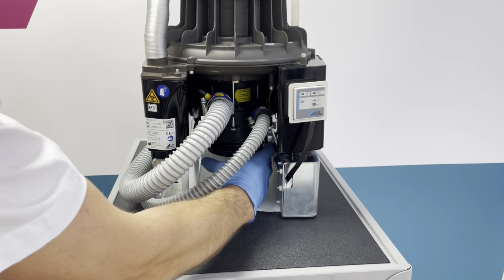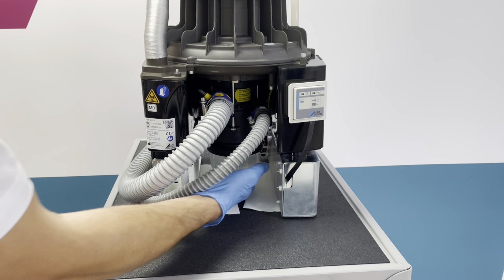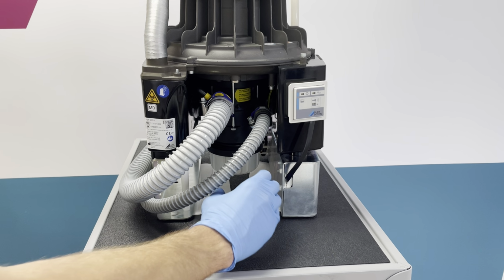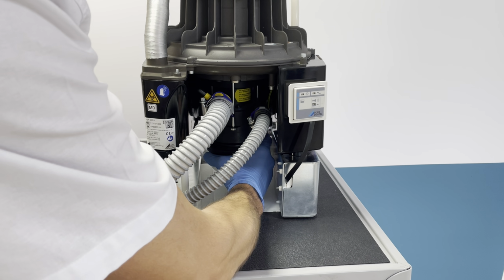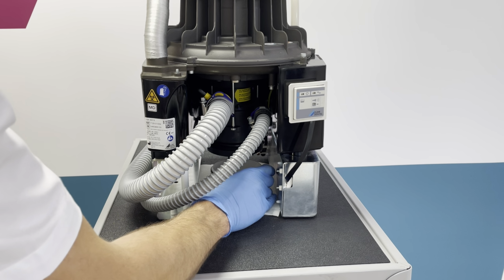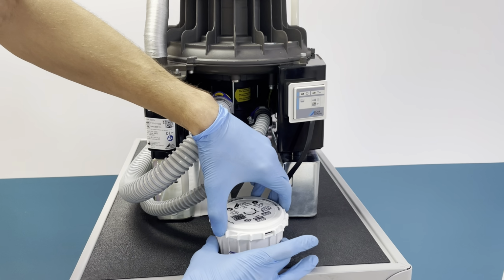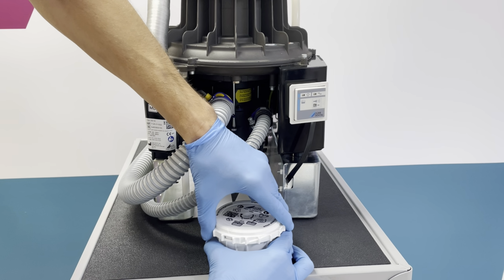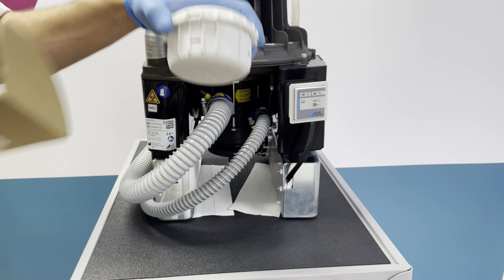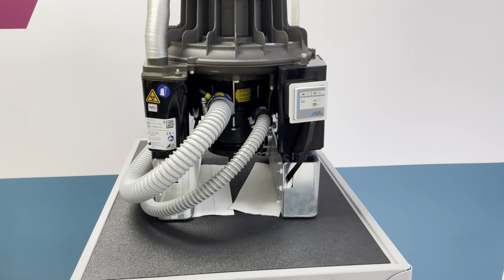If you can try and grip the sides of the pot, it will allow you to put the pot down onto the base of the cabinet. But if you're holding it from underneath, it'll be quite difficult and you might spill any water in there. So 1/4 of a turn or 1/8 of a turn, just drop the pot onto the cabinet, pull the pot out, put this lid on, 1/4 of a turn clockwise, that's now secure. Back in the box, clearly labelled as amalgam waste.